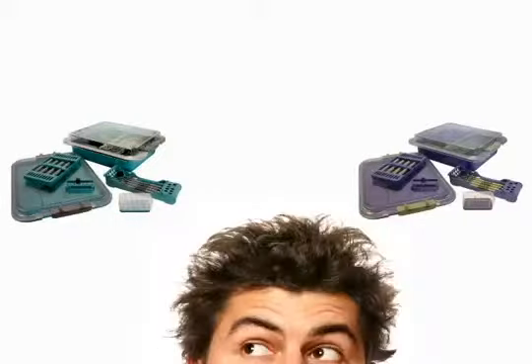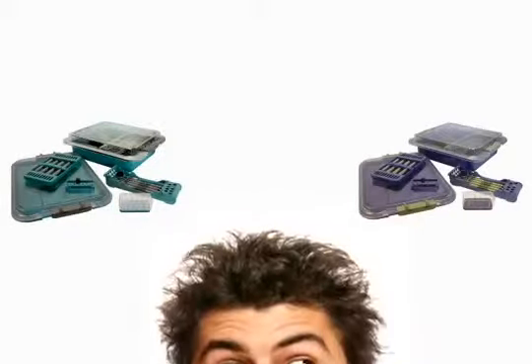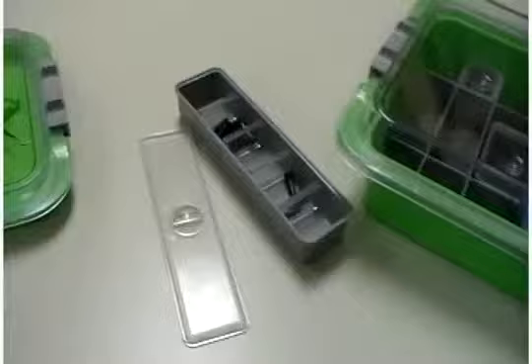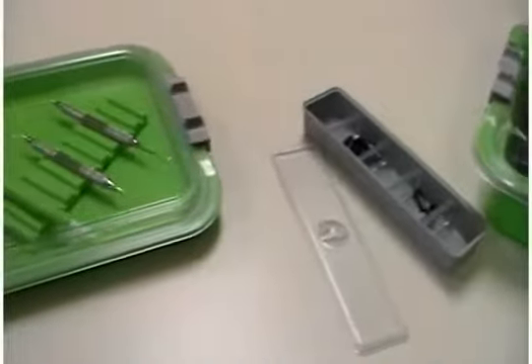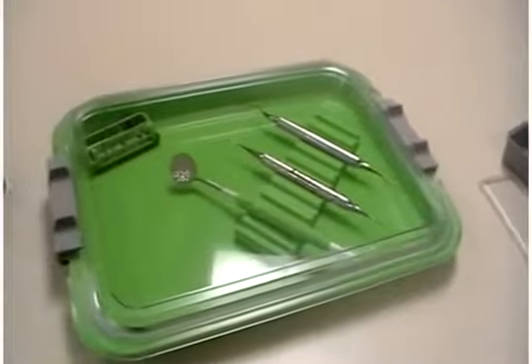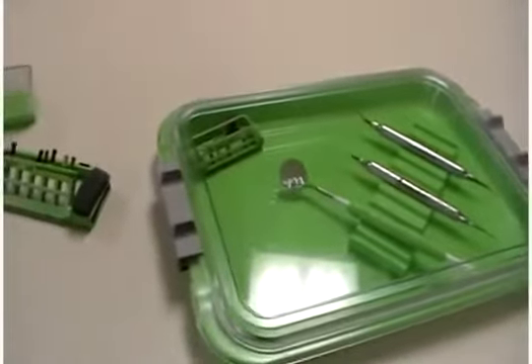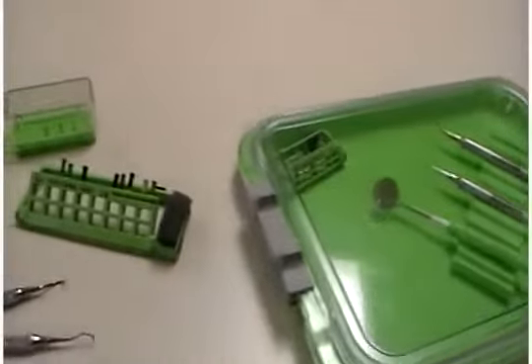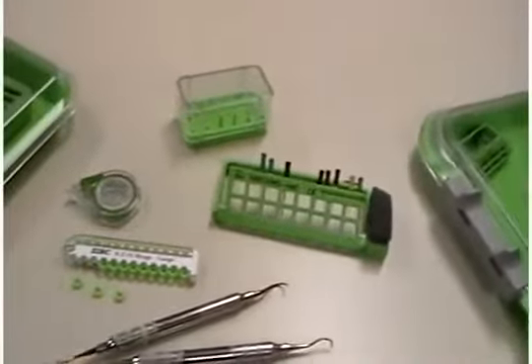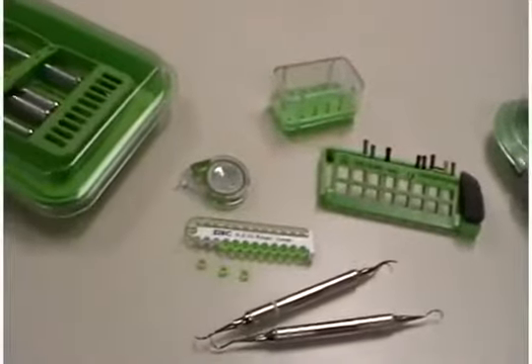A color code system offers the eye instant recognition and reduces the time searching for items you need, which is very valuable in the dental office. It's simple to start. Assign a color to each procedure in your practice and then identify everything by placing it into the appropriate color organizer, such as a tray, tub, instrument cassette, or burr holder. Items that do not fit into the color-coded organizer can be identified by using color-coded rings and tape.